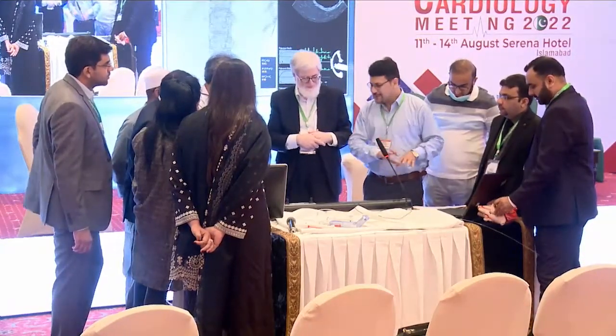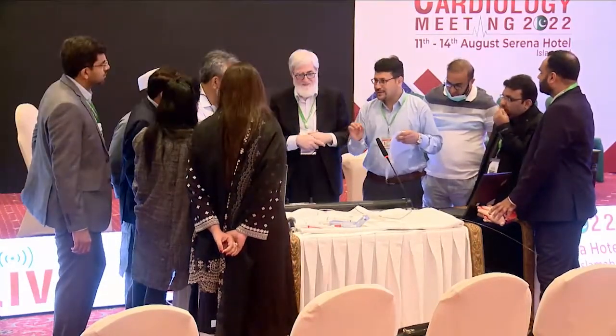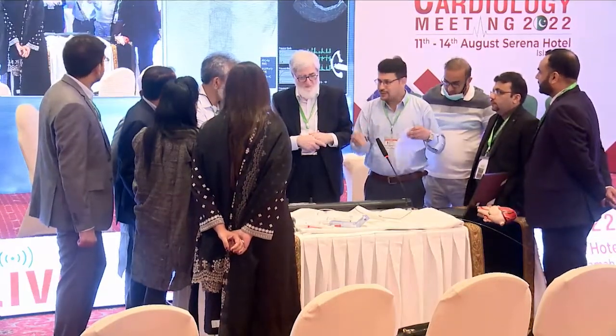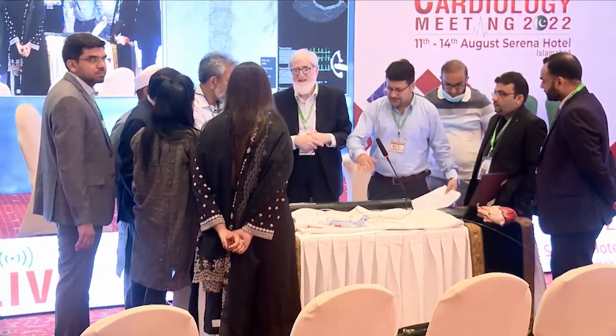Okay, put the wire. I'll just make it clear before this session. This is virtual reality based. There are proper steps to follow because sensors are there. If your technique, your maneuvering, or your insertion is not correct, then ultimately the system will not detect it. In real life, you can go at your own pace. So these are some limitations, and it's based on the expertise level to configure that.